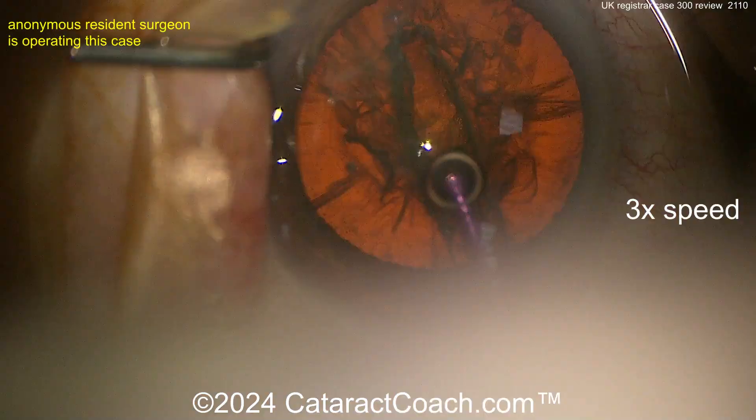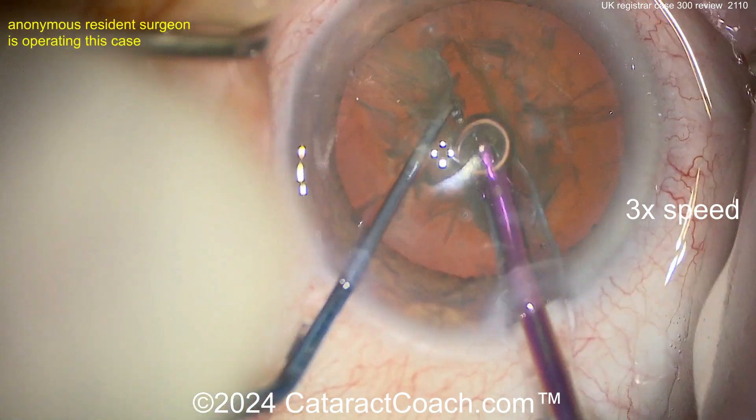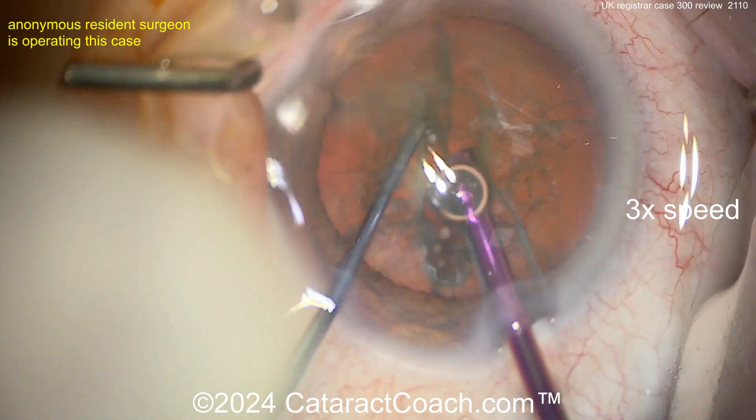Compare that to yesterday's video where someone else did case number 30 — and that wasn't the case there. Now let's see splitting it down the middle — we're going to do a stop and chop, probably. Nicely split.